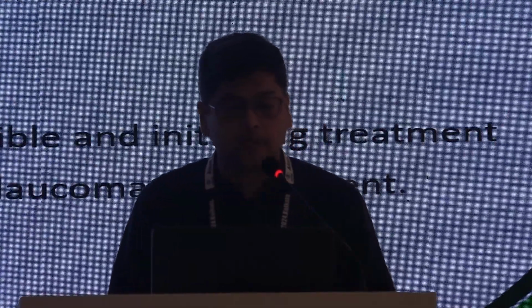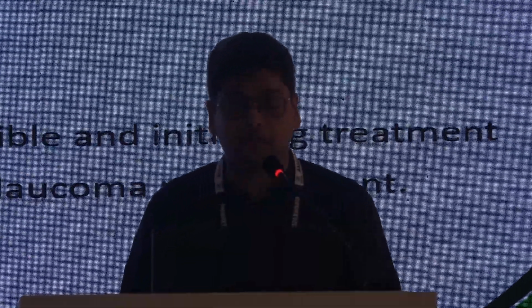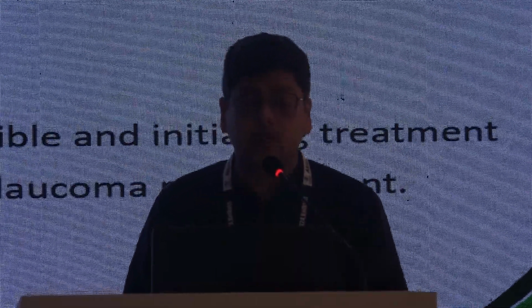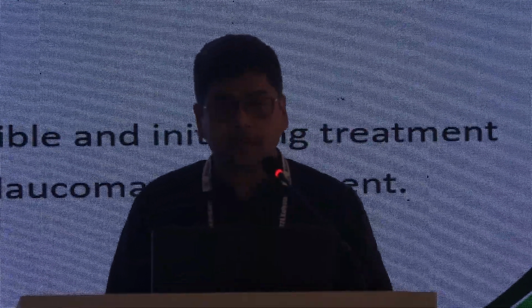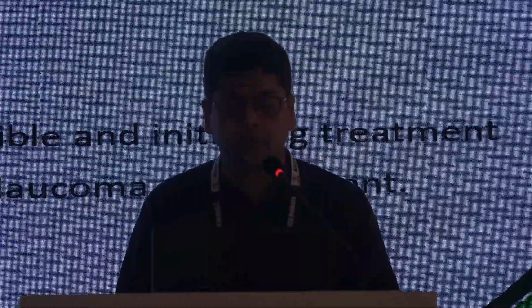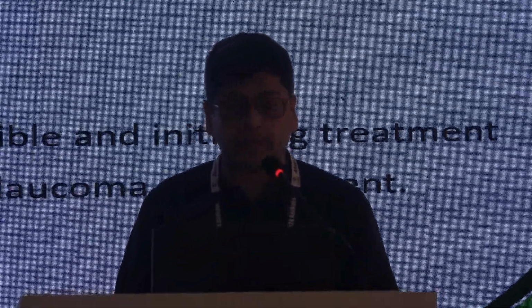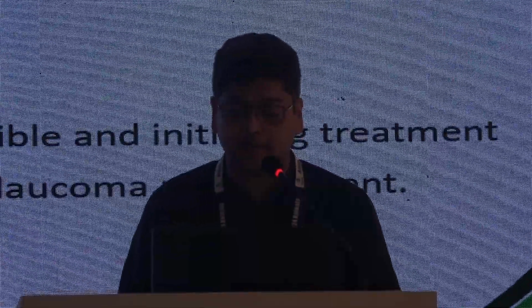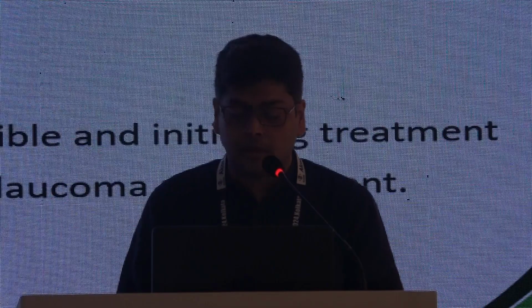So what is visual fields? Simply put, it's everything we see simultaneously while we fixate our gaze in a particular direction. And glaucoma causes defects in this visual field because of particular patterns of RNFL defects. It causes particular patterns of visual field defects, and we need to recognize these defects as early as possible and start treatment with minimal damage to the visual field, which is our main agenda.